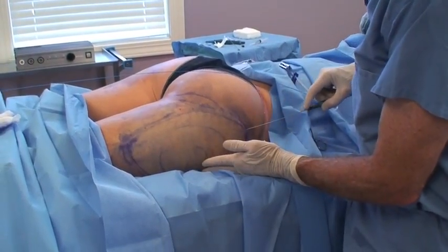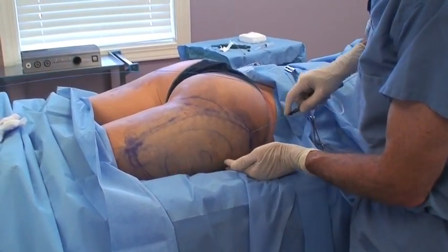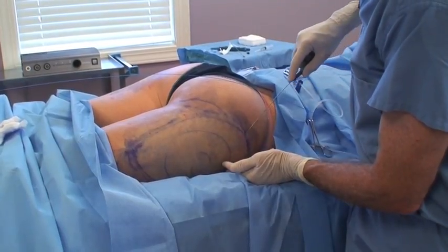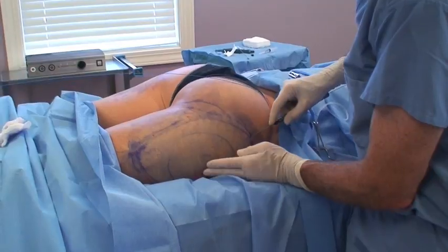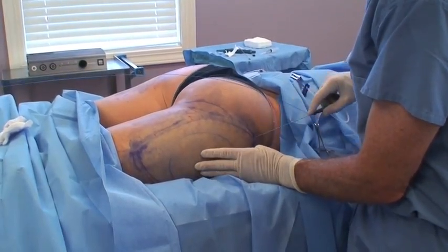You can see with the laser here — you can see the tiny light underneath the skin. This is the aiming beam, and this allows us to know how close we are to the skin so that we can come up fairly close and help heat up the skin for tightening.